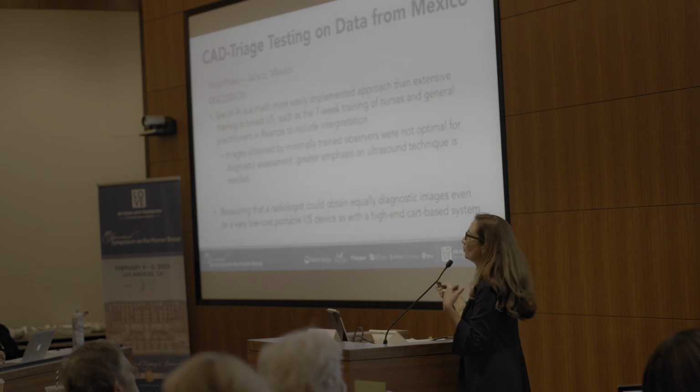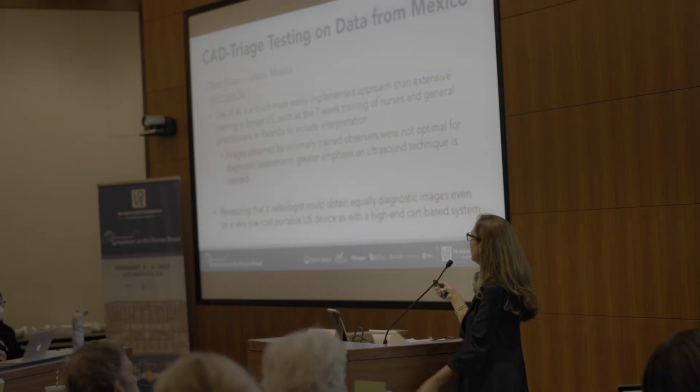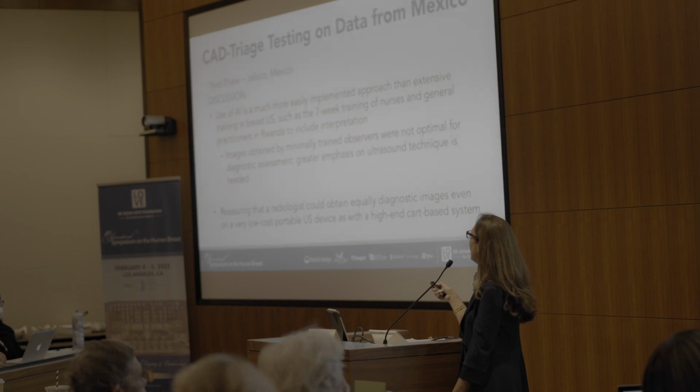Use of AI is much more easily implemented than having to train a doctor or a nurse on how to read the ultrasound images. It was reassuring that the radiologist could obtain diagnostic images using both the low-cost portable V-scan and the high-end ultrasound machine.